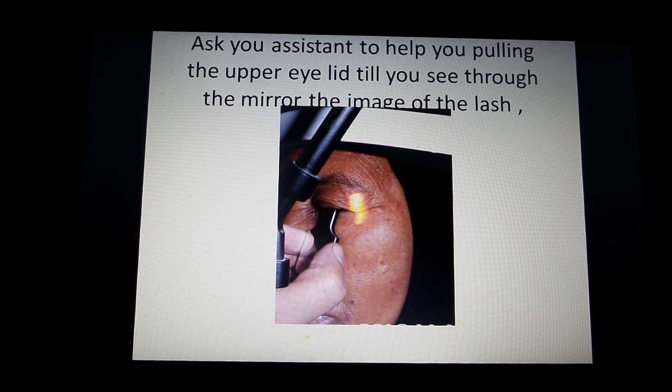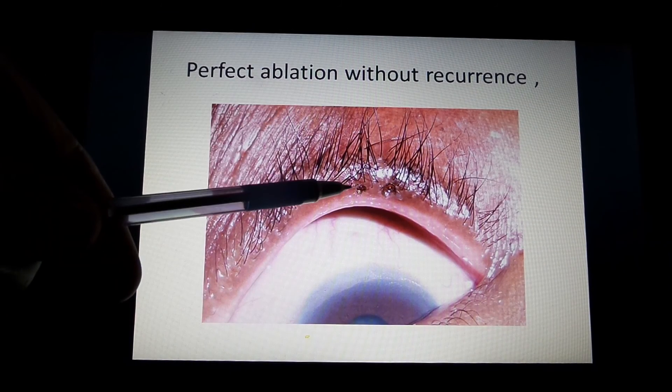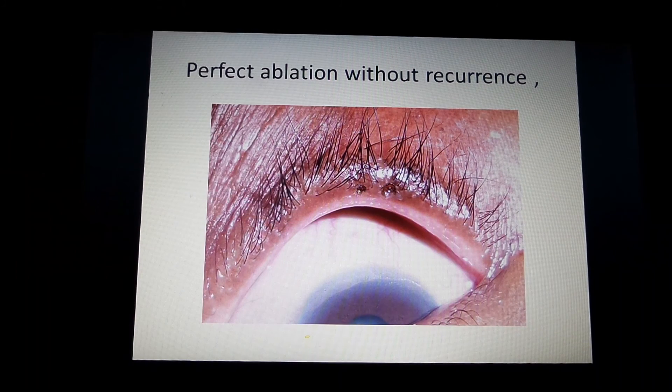Ask your assistant to help pull the upper eyelid until you see through the mirror the image of the lash. Adjust the mirror and start the laser. The mirror also fixates the upper eyelid for good ablation. Here the two craters show good destruction of the follicle — perfect ablation without recurrence.